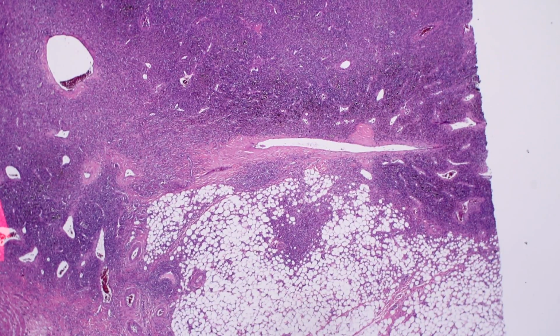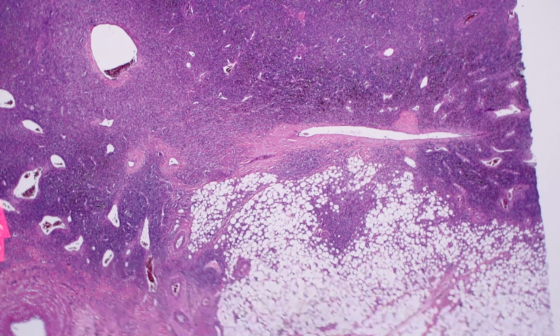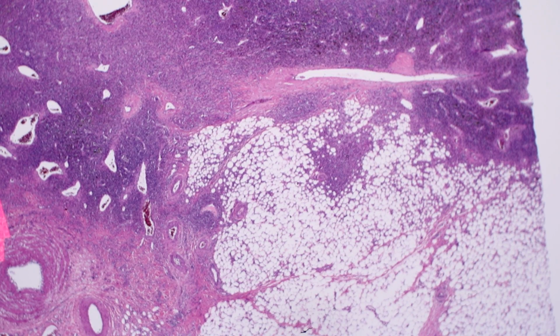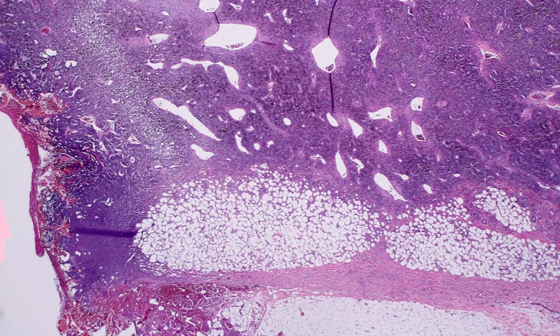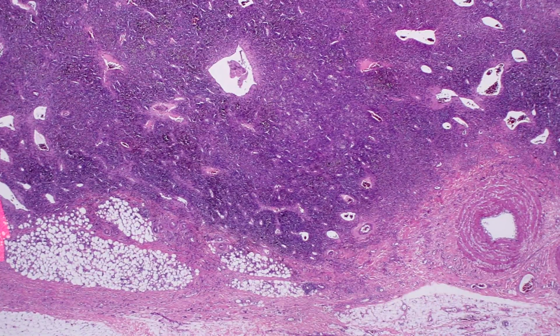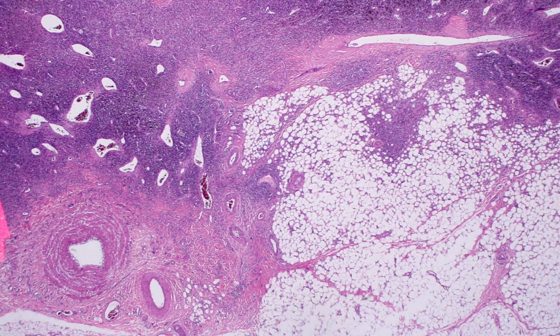Not only is this thing cellular, it may have large cells, pleomorphism to some degree, mitotic activity, but then it trickles into and looks like it's infiltrating adipose tissue at the edge, okay? Dermatofibromas often do this, even though we know that infiltration of fat is the buzzword for DFSP. DFSP usually has a honeycomb pattern. It deeply infiltrates fat and replaces large zones of the subcutis, leaving little islands of fat stranded way up in the middle of the tumor.